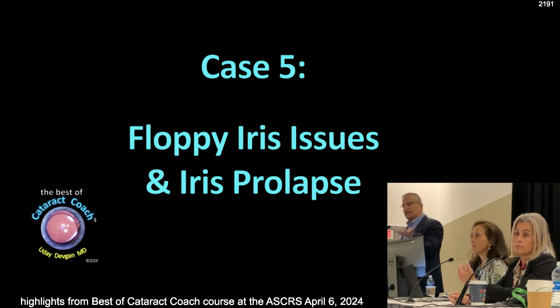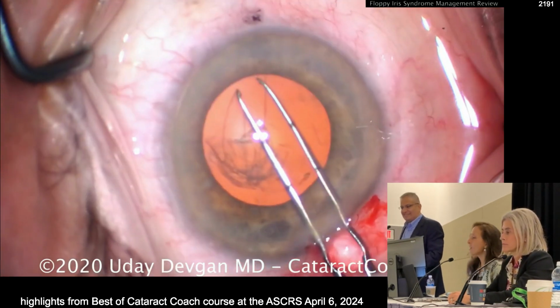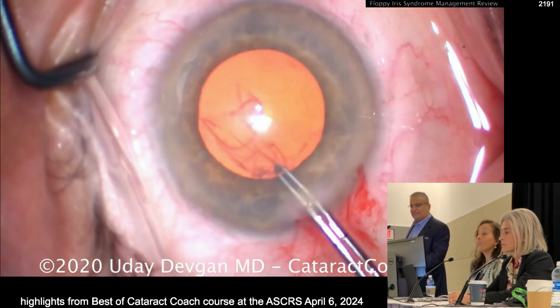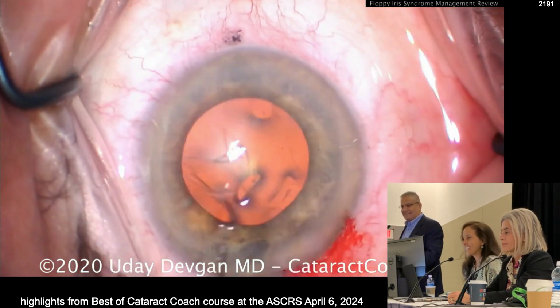And then prolapse it up and get it above the iris. But how do you get a big rexis if you have a small pupil? Jedi mind force, you can do it underneath it. I'll show you. You should show us a video. It's coming up.